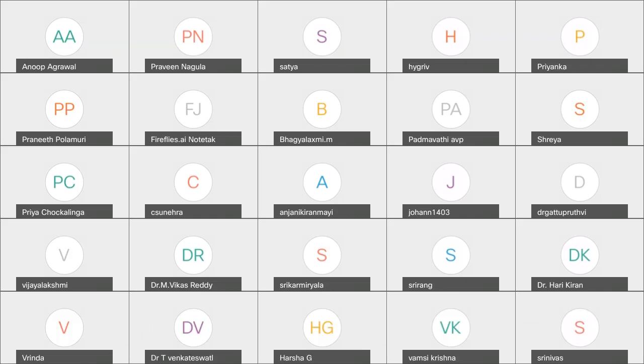I'll just read the comments which were at the end of that 72-hour Holter. The patient's predominant rhythm was sinus rhythm. Ventricular ectopic beats were noted in single, pair, and run forms. Supraventricular ectopic beats were noted in single and run forms, and no patient-triggered events were documented. In this ventricular ectopy, he had a total of about 1056 ectopics, and he had runs of VT with the longest run of 13 beats with a heart rate of 177, and the fastest run was 3 beats with a rate of 186 beats per minute. So this was the 72-hour Holter report of this patient.